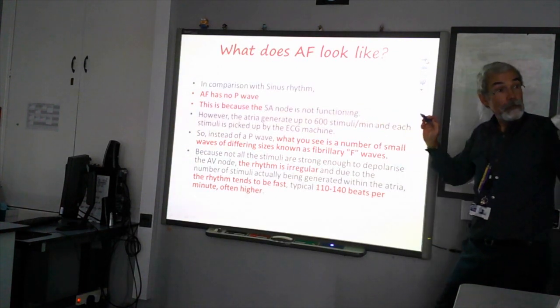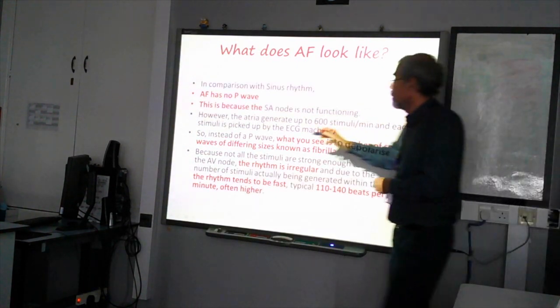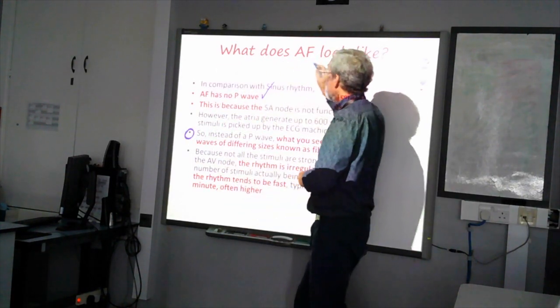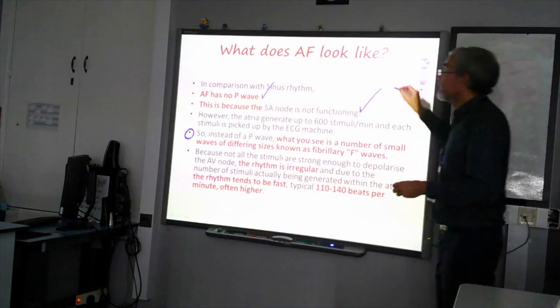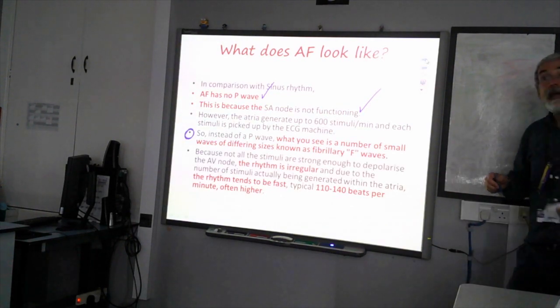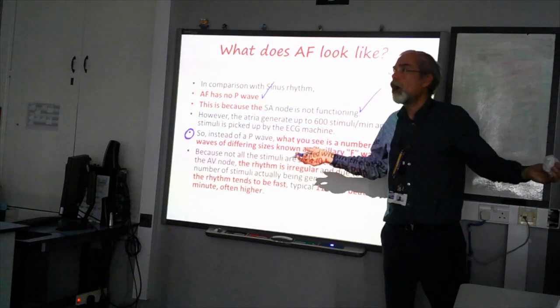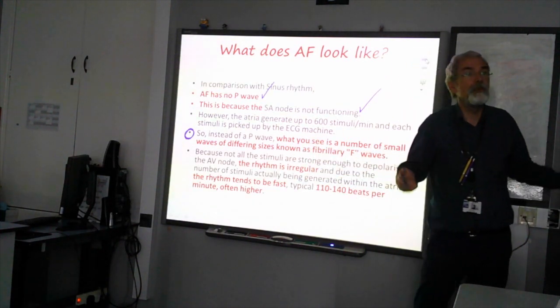Now, can I just draw your attention to one really important thing that I need you to remember, which is this one. Because we now know there's no P wave, because we know the sinoatrial node isn't functioning. And somebody asked a really great question before, so what is making the heart beat, Dave, if we haven't got this P wave?